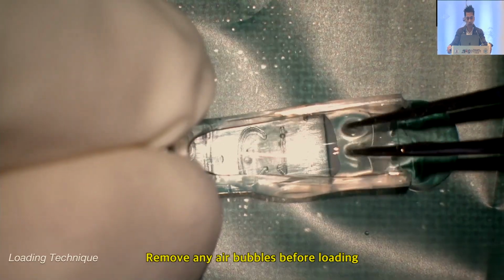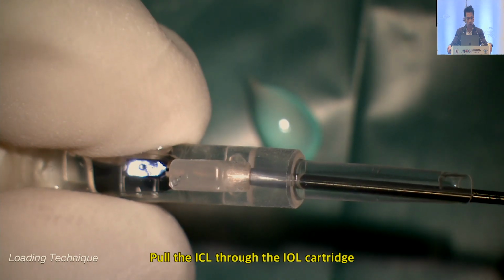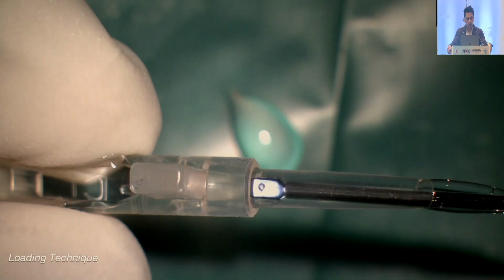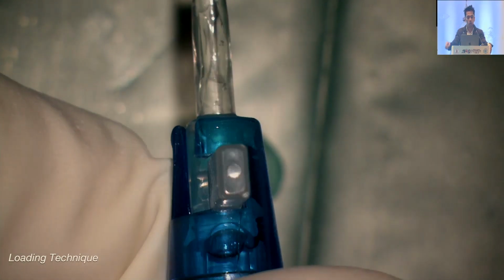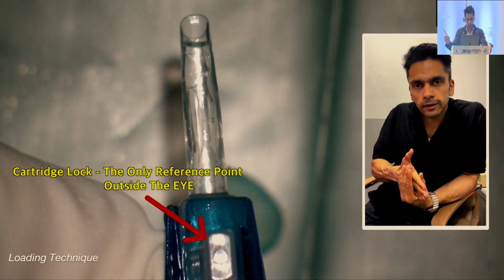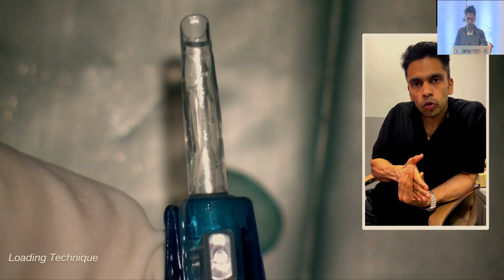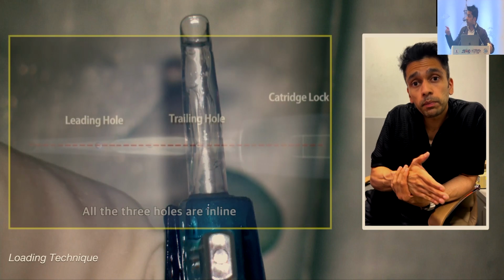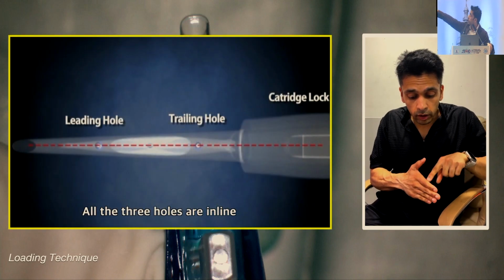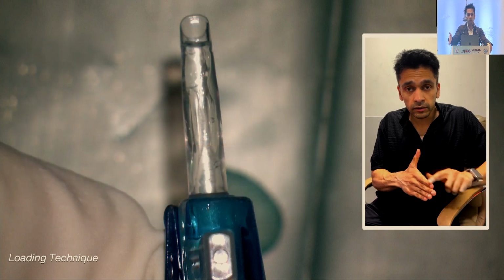When you place the lens, make sure that you're concave down and convex up. Holding the ICL and pulling it all the way through is extremely important, but even more important is visualizing the orientation holes through that, outside the eye, as a reference point. So the basic idea is use the reference point of this cartridge lock which you're seeing over here. The cartridge lock is your only reference point when you're inside the eye.